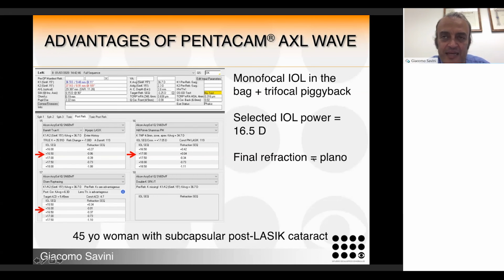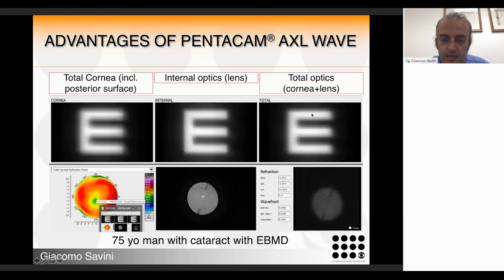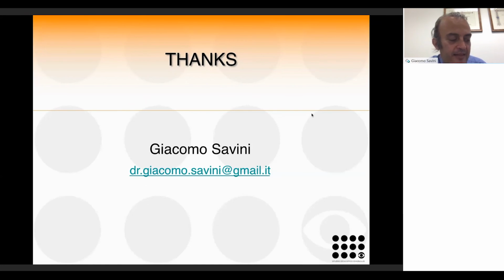Then she finally had a piggyback after we implanted a monofocal, and the refraction was stable. We implanted this piggyback multifocal lens, and you see that on the right, the total optics is perfect and the patient is very happy. And this was the last one.